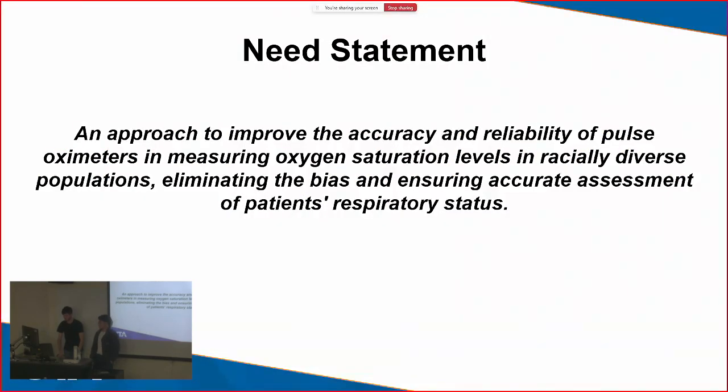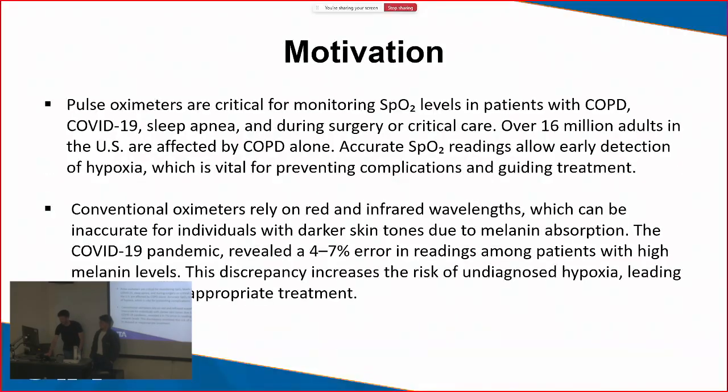Our motivation: pulse oximeters are critical for monitoring SpO2 values in patients with COPD. Over 16 million adults in the US are affected by COPD alone, and accurate SpO2 readings allow early detection of hypoxia, which is vital for preventing complications and guiding treatment.